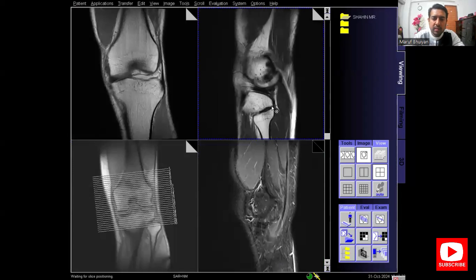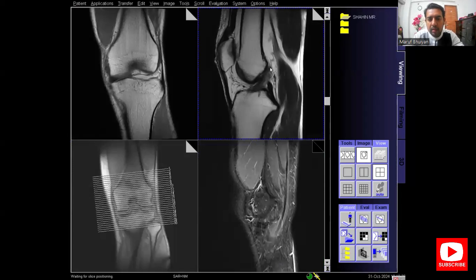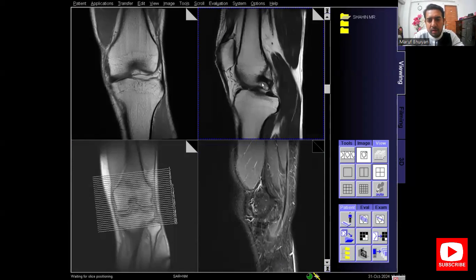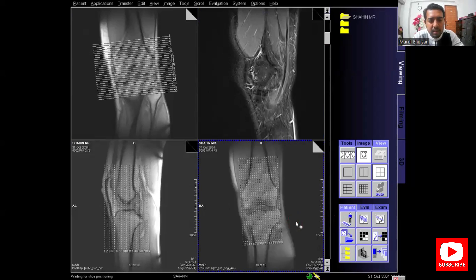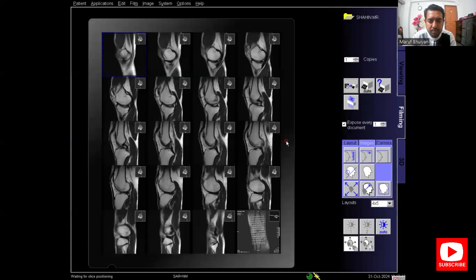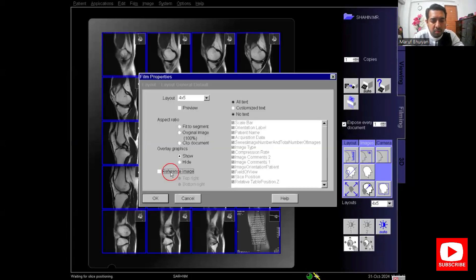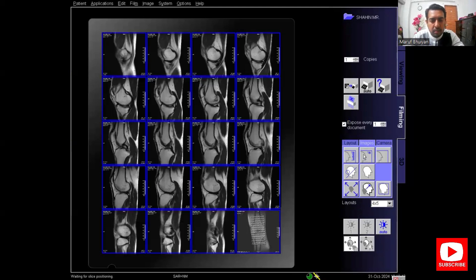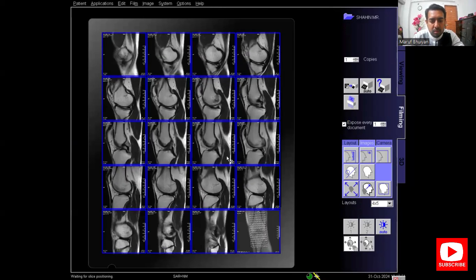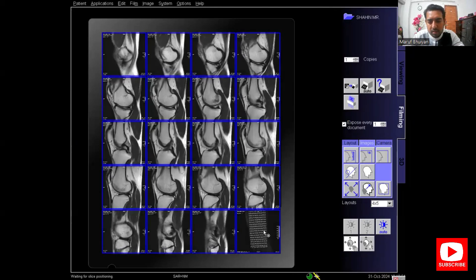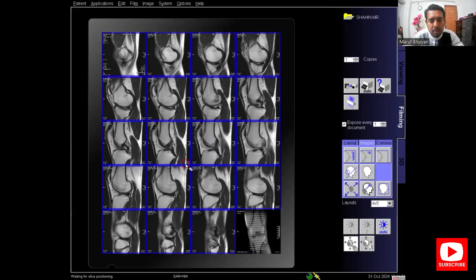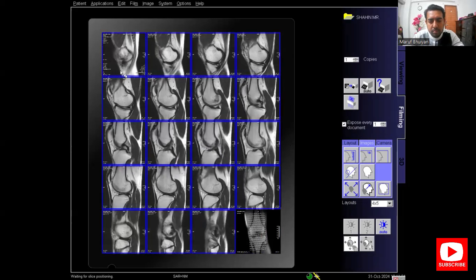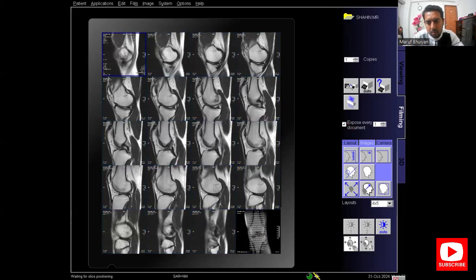This is the T2 sagittal. This is the ACL — anterior cruciate ligament — and this is the PCL — posterior cruciate ligament. I am sending the T2 sagittal series to the film sheet, removing the reference images from the segments, zooming the images, adjusting the reference image, and printing the film.